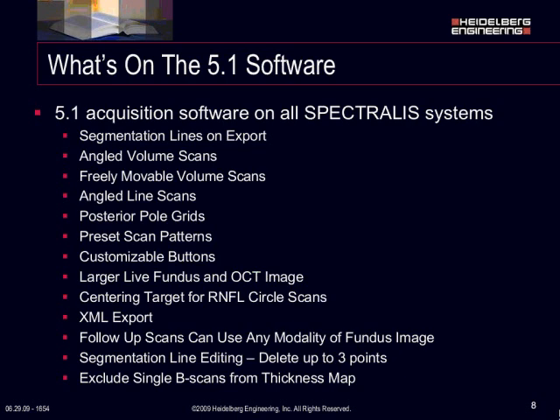You have a larger live fundus image, and you also will have a centering target for the RNFL scans, which we'll show you in a little bit. And you can also export your data as an XML file, which is really nice for anybody who's doing any research, so that you can then import the data directly into Excel.